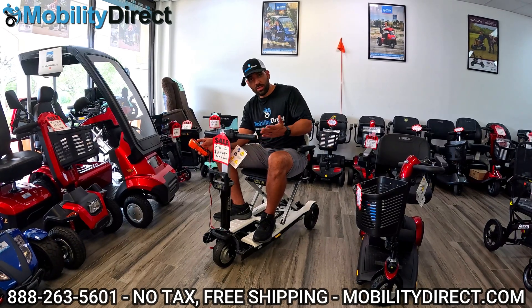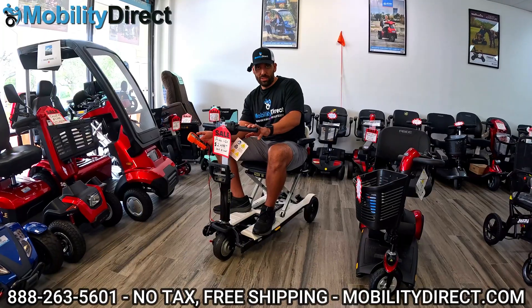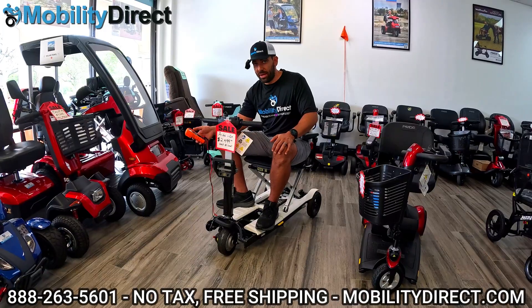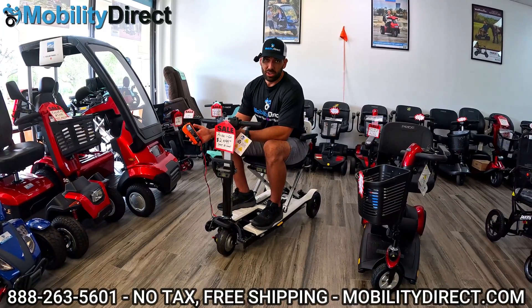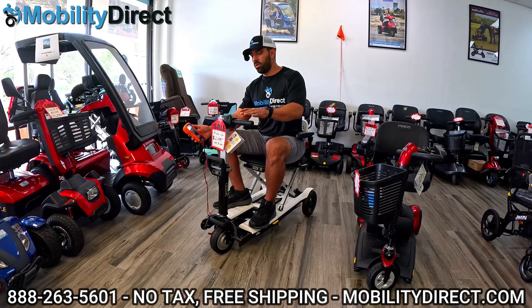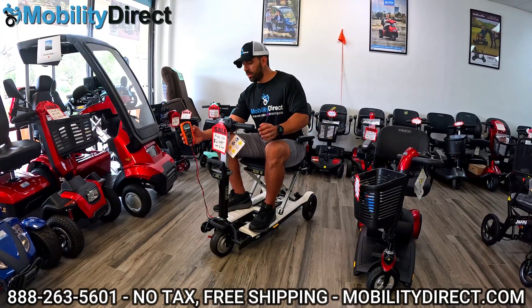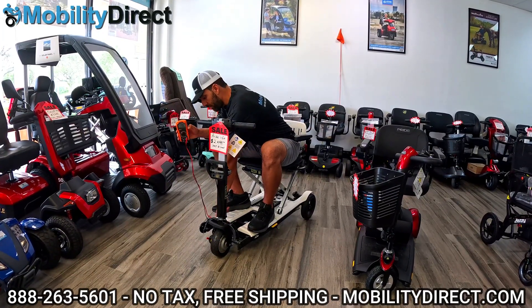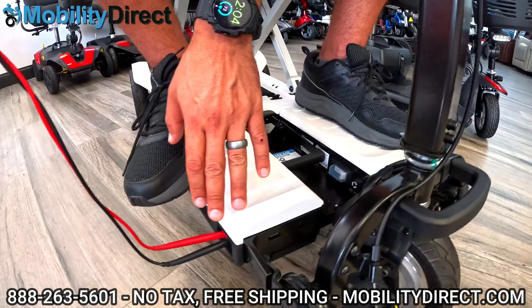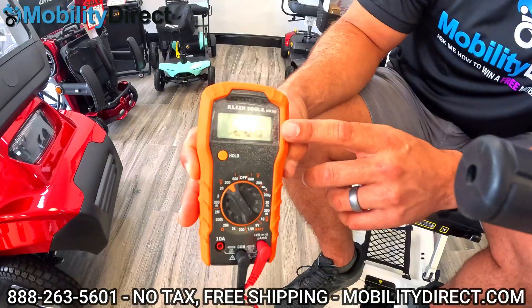Now I'm on a different scooter — this is called the iGo by Pride Mobility. It's another GoGo and it has lithium batteries. If you have a GoGo Endurance, an iGo, or a Super Portable, these all have lithium batteries and the voltage readout is going to be much higher. You can always check the specifications in your user manual to see what the voltage is for your batteries. For lithium batteries, most of the time it's going to be closer to 29 volts at a full charge. I've plugged the positive and negative probe into the charging port on this model, and it's reading 28.6 volts.